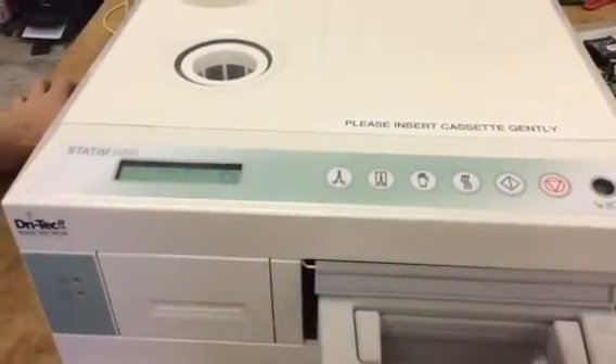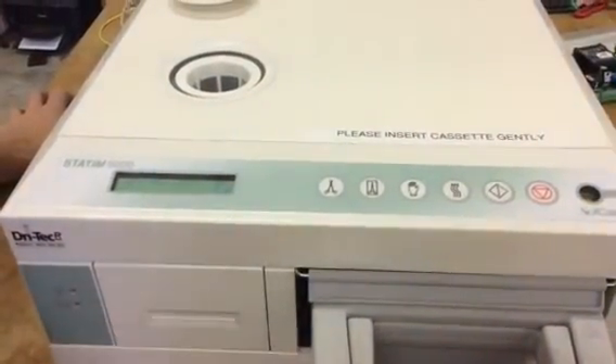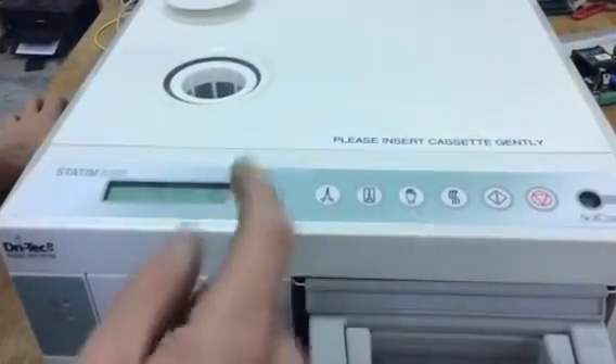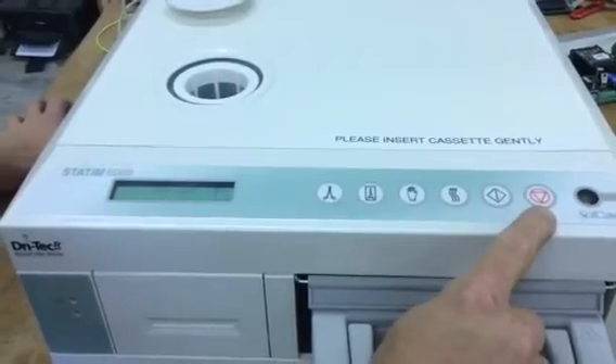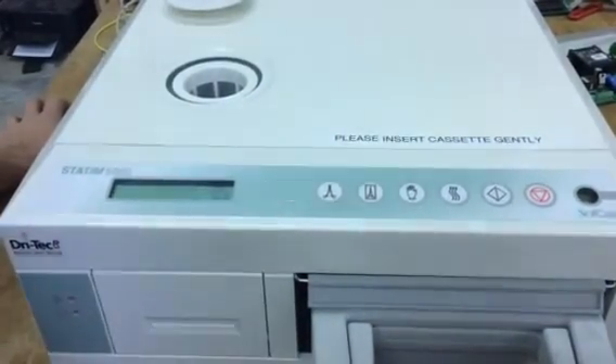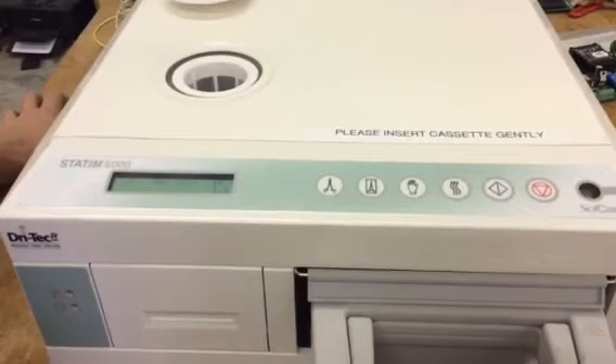It's going to run for about three minutes and then it's going to beep. Once it beeps a couple of times, you can hit the stop button and power it down, or hit the stop button until it says 'select the cycle,' then power it down and turn it back on to see if it worked.